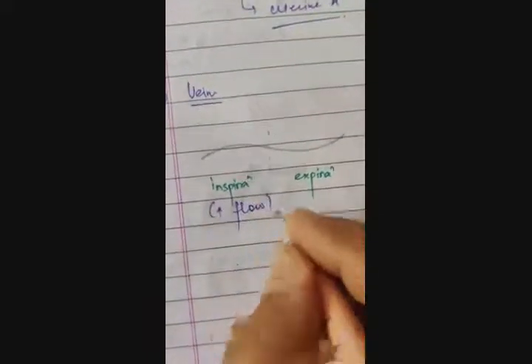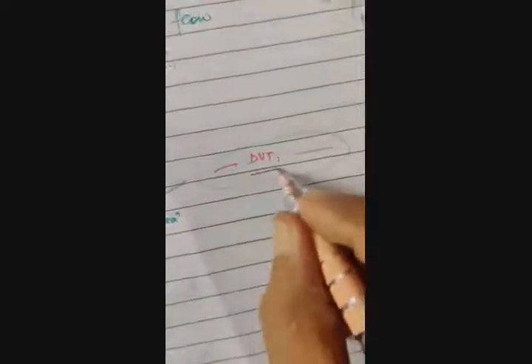It's very simple. It's just like this. Inspiration, because high flow is during inspiration, that's why it's upgoing, and this is downsloping. In DVT, because there's not going to be any flow through the vessel, that's why it's a straight line. Okay, now our main topic.